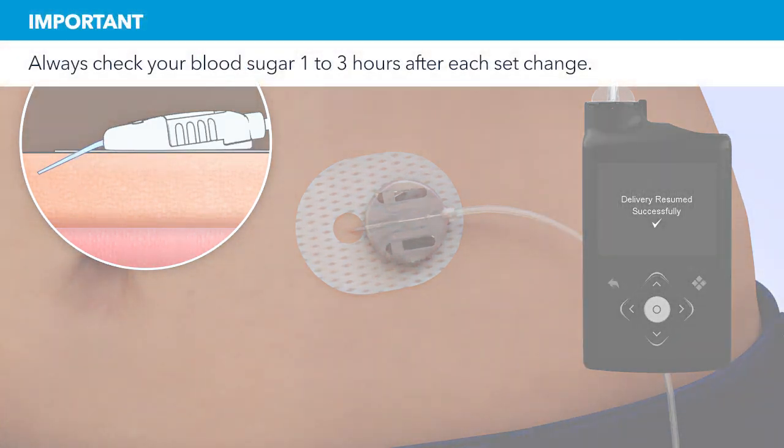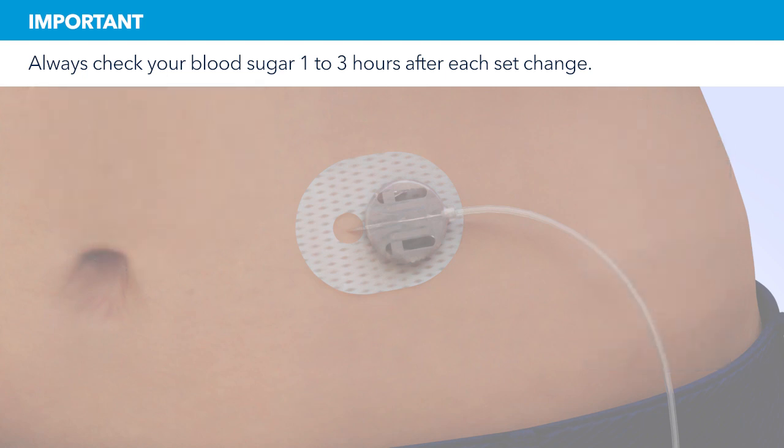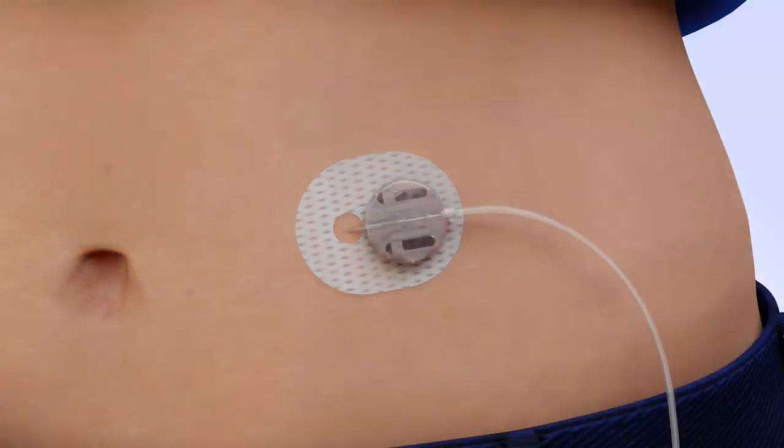Remember, 1 to 3 hours after inserting a new set you should check your blood glucose. Checking your blood glucose is the only way to confirm your infusion set is properly inserted and that you're receiving insulin. Congratulations! You have successfully filled your reservoir and changed your site.